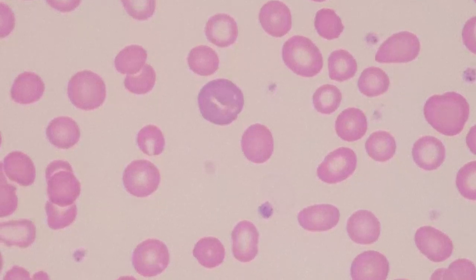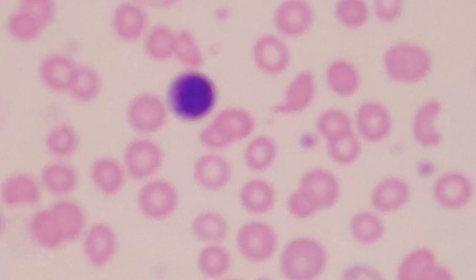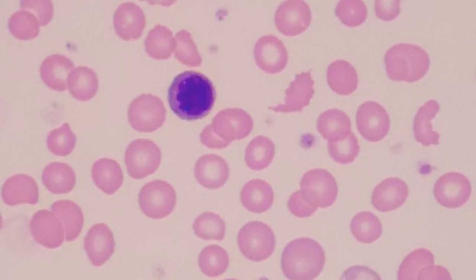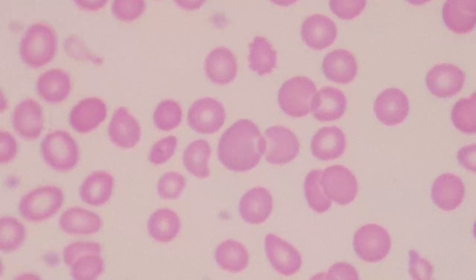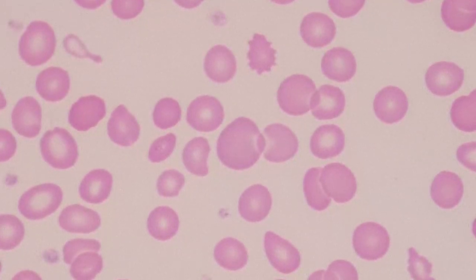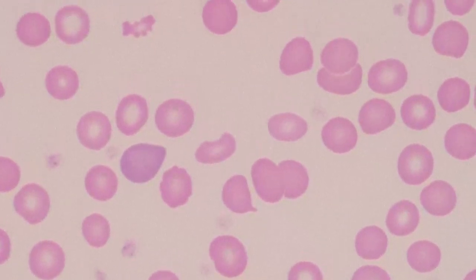Now, another thing kind of interesting here is we have a nucleated red blood cell. Those are something that you don't normally see on the peripheral smear and that you would put on your differential report. Okay, the last thing that maybe is of interest on this slide, let me find a good field here.